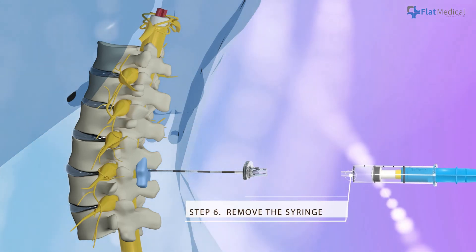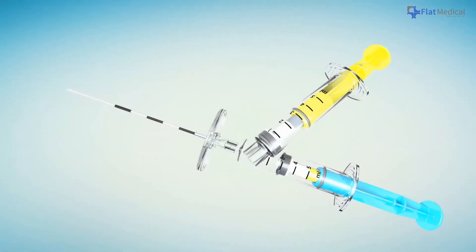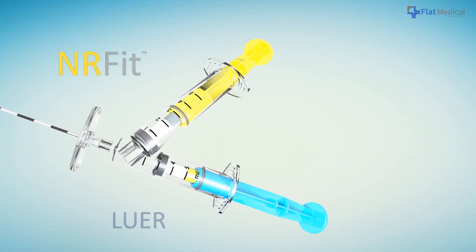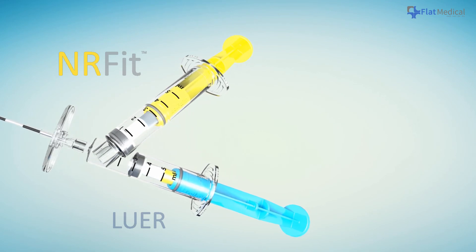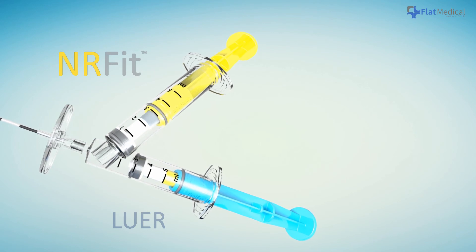Remove the syringe and insert the catheter to complete the injection. Providing a clear visual signal via an intuitive way, Epiphaith is beneficial to both beginner and senior physicians, transferring the technique into a safe and convenient way.